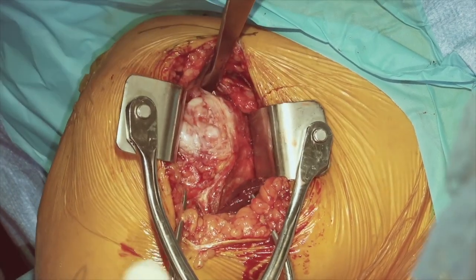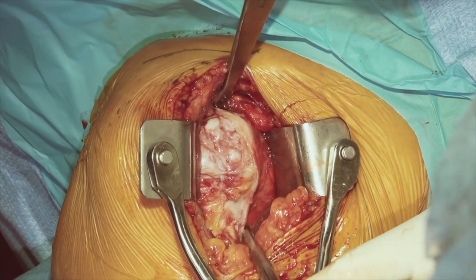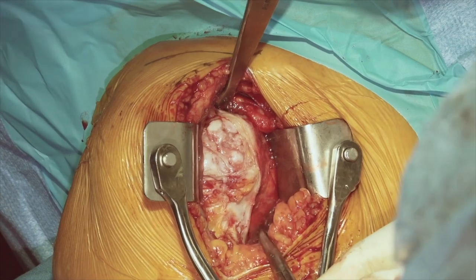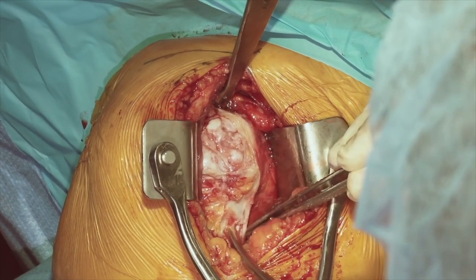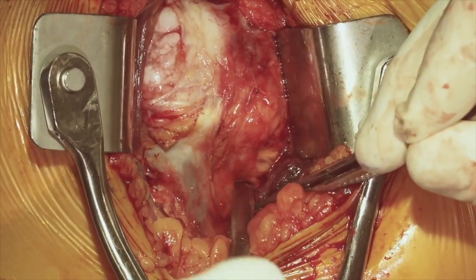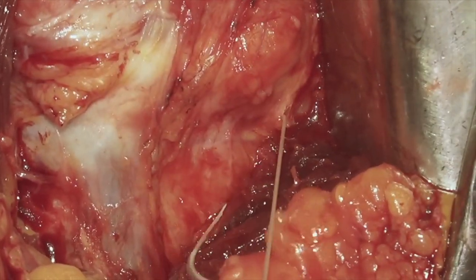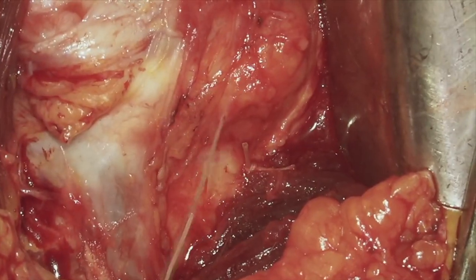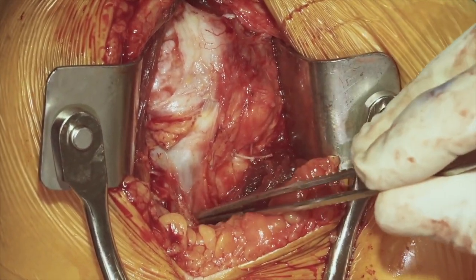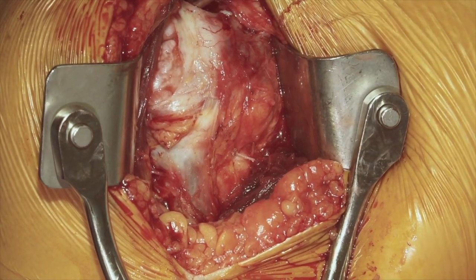We'll open up this tissue and start to get our deeper exposure. We can see the subscapularis has failed and the supraspinatus has failed. As we look inferiorly, we're looking for the biceps tendon, which was released or torn from the previous surgical procedure she already underwent. We'll externally rotate the arm and identify the anterior circumflex vessels, then go ahead and ligate those with number one Vicryl sutures to minimize the bleeding that can occur from them. At this layer of exposure, we've taken care of the biceps tendon — which in this case is autotenodesis — and we have ligated our anterior circumflex vessels.